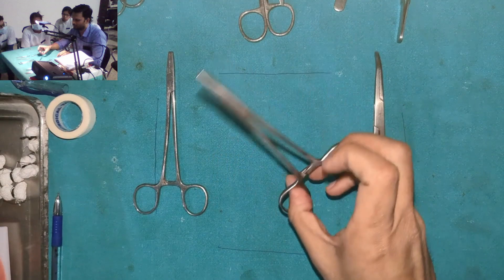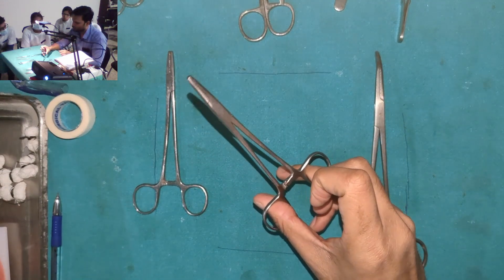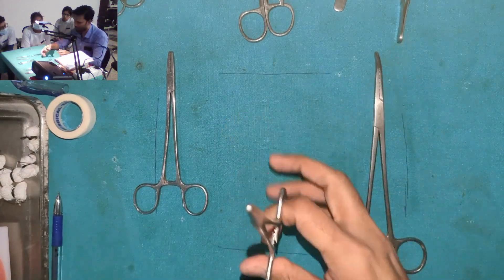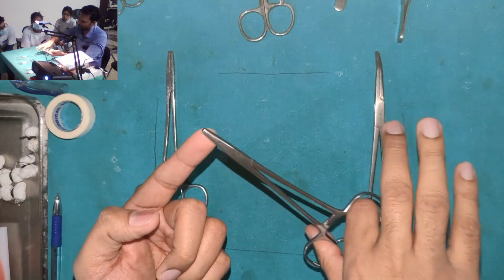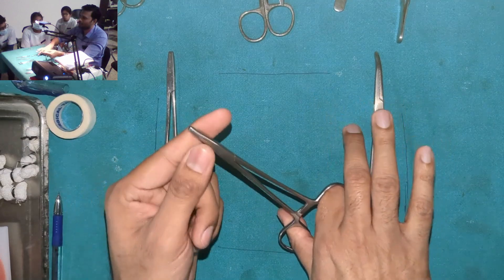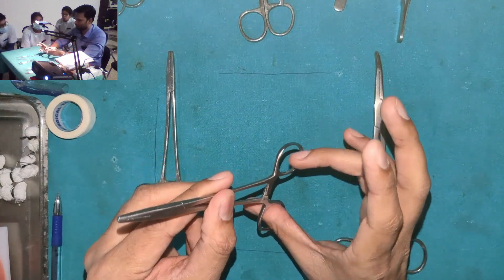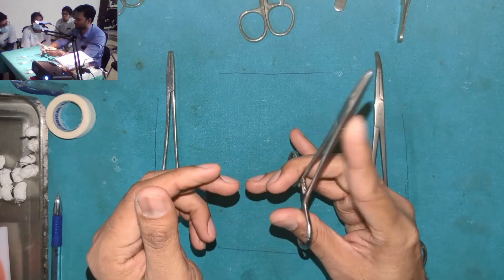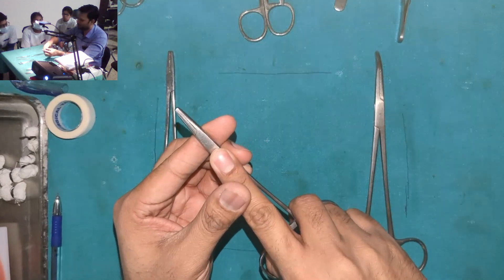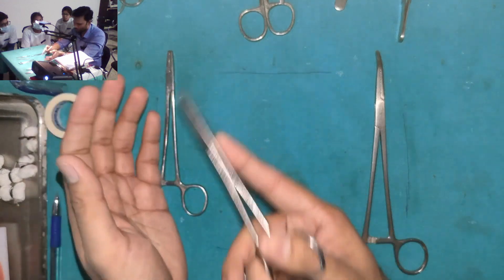Suppose you are going to insert a needle into a tissue that is very stiff and fibrous. If your grip is a two-point grip and you are pressing the needle inside, the instrument wobbles and you cannot apply the force you need. That is why you use the thumb, ring finger, and index finger. When you insert, you use your index finger to stabilize the needle holder so adequate force will be applied — I'll show it to you.